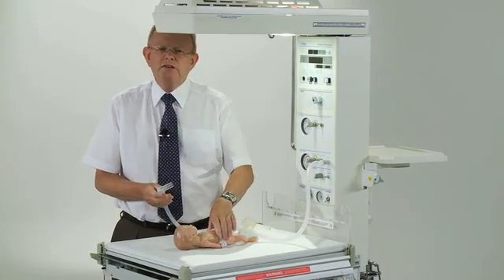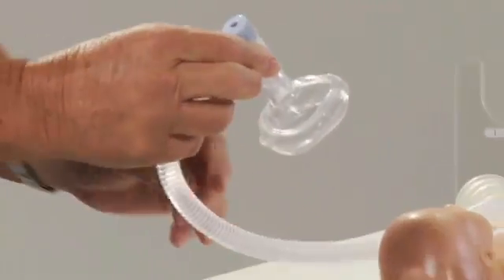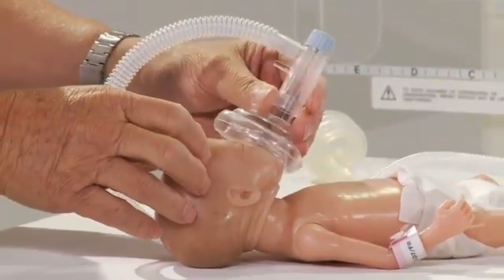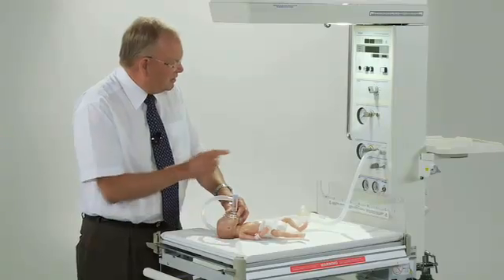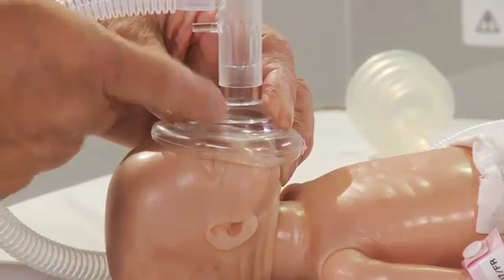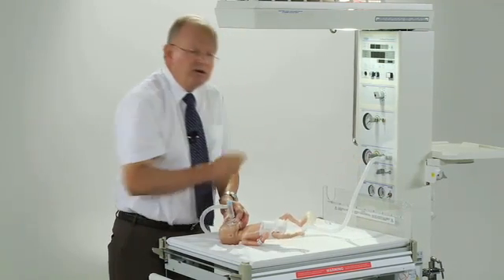First of all, if we're going to give the baby face mask CPAP, we would attach the mask to the device. Remember, I've got it now set to deliver a CPAP pressure of 6. I'm going to just turn the baby sideways a little and put the mask on the baby's face, with an even pressure down and some chin lift. And I watch here to make sure that I'm delivering the CPAP pressure. In this situation, the baby would be breathing spontaneously, breathing the gas being delivered — at the moment I've got it on air — with a CPAP pressure of 6 centimetres of water.